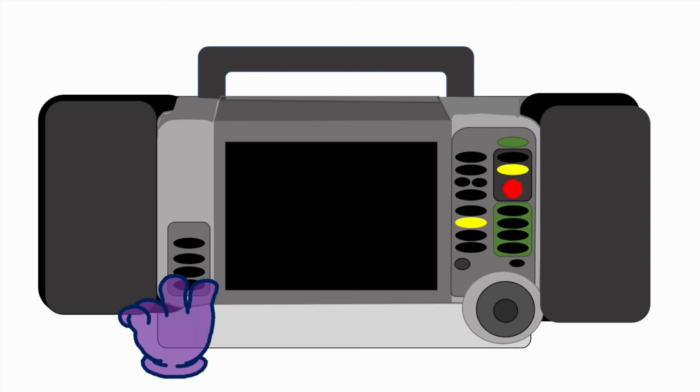Obtain the 12 lead by selecting the 12 lead button. The monitor will then ask you for the patient's age and sex prior to obtaining the 12 lead for computerized interpretation. After completed, push the dial for enter. The 12 lead may take several moments to process, and it may ask you to accept the reading when there's too much artifact or cancel.